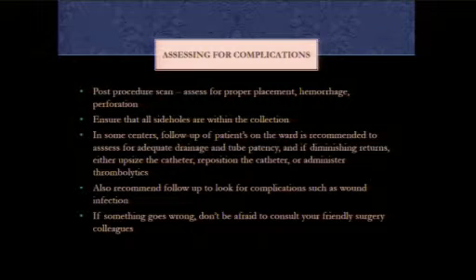So if you have a collection that's not draining, you want to assess and ensure that all of your side holes are within the collection. This also prevents seeding of abscess material outside of the abscess and worsening the patient's sepsis. In some centers, particularly in the States, they recommend that radiologists follow up on patients on the ward, and this is to assess for adequate drainage and patency.